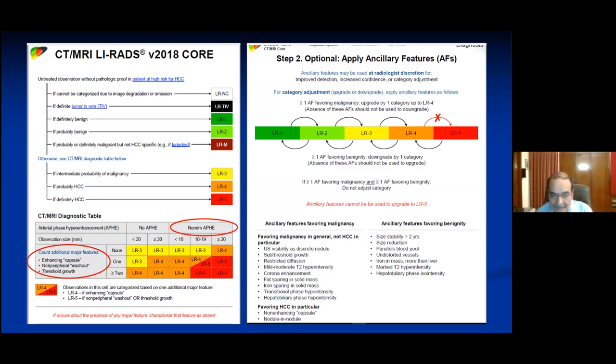It's similar to the BIRAD nomenclature, which is widely accepted in breast cancer, but increasingly, we want all of you to use the LIRAD nomenclature. We use this in our radiology reports. It's a good way to be on the same page to communicate. And this basically grades the degree of suspicion from LR1 to LR5.